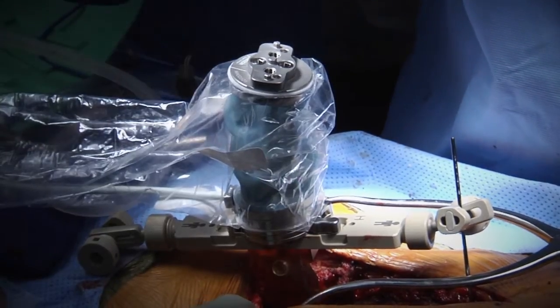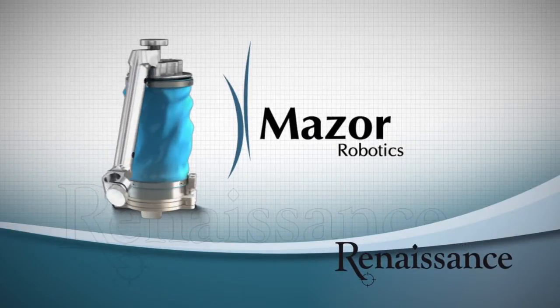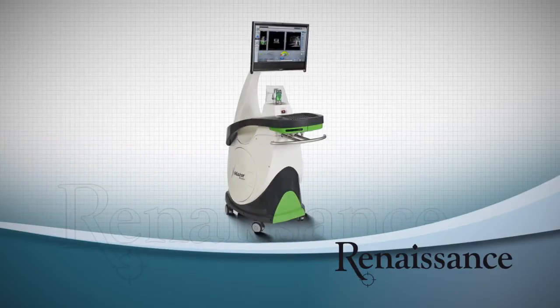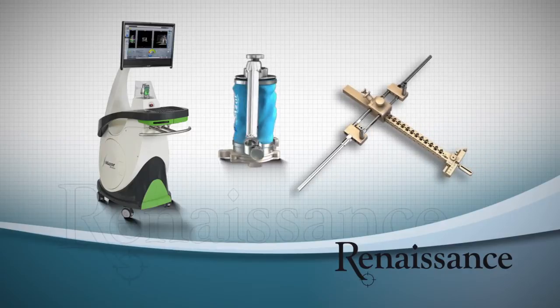In the next six minutes you will be introduced to Renaissance, Mazor Robotics guidance system for spine surgeries, and learn how it works. Renaissance includes a workstation, advanced software, guidance unit and several mounting options.